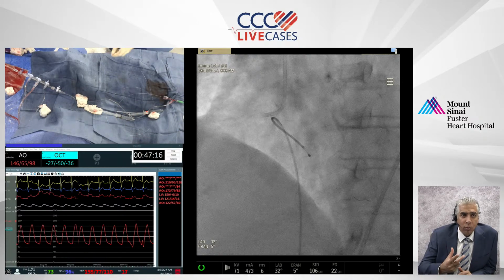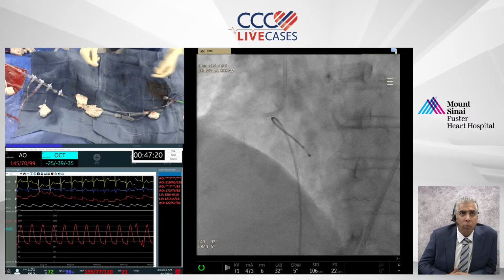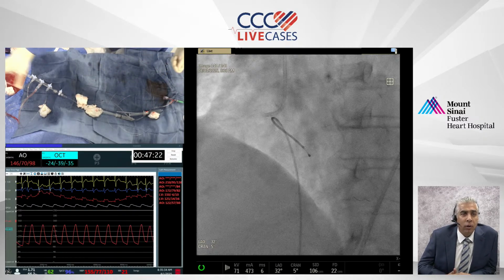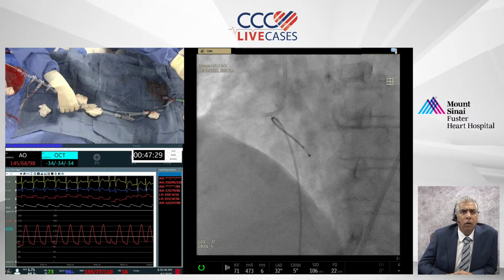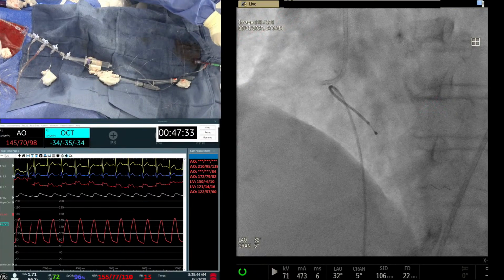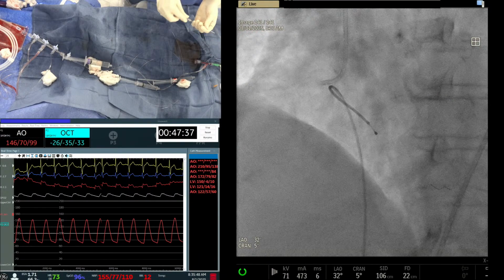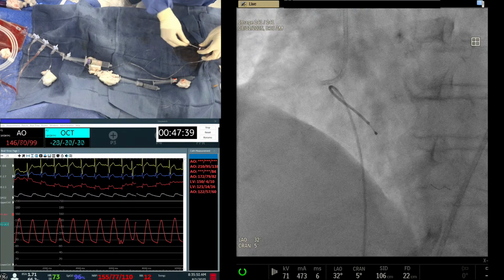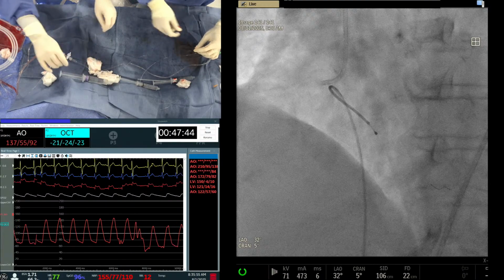Sometimes we'll, I don't know. I think giving sodium nitroprusside here would be reasonable, or I have a nipride ready. Yeah. Will has nipride ready for me, but I'm going to wire quickly because two things can happen when you see ST elevation as soon as rota is done, right? One, you can take a picture right now. Two things you need to be ready for. One is slow flow. Another one, did we cause a dissection with a large burr? So you cannot do any work on the rota wire.